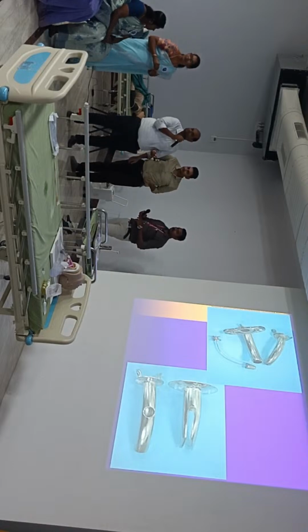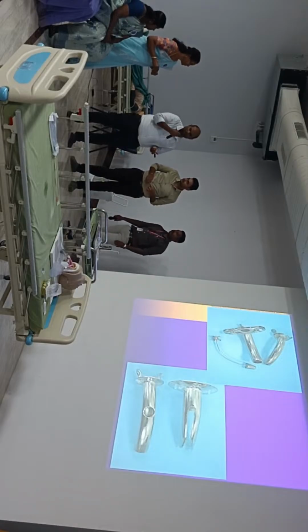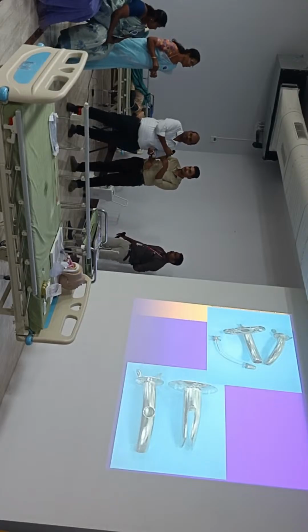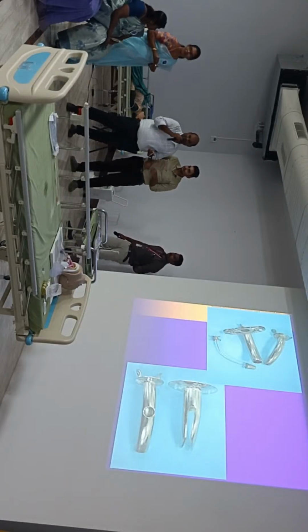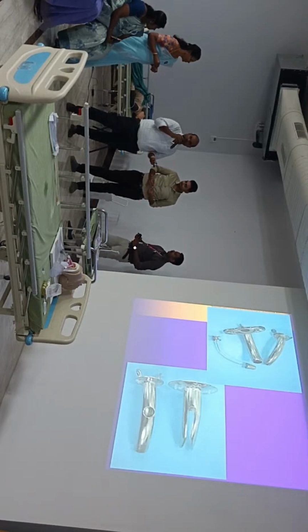Pardon? Where? Where do you see that? Patient conscious, violent cough. Exactly. Patient is having a violent cough, so we don't want the tube to come out.